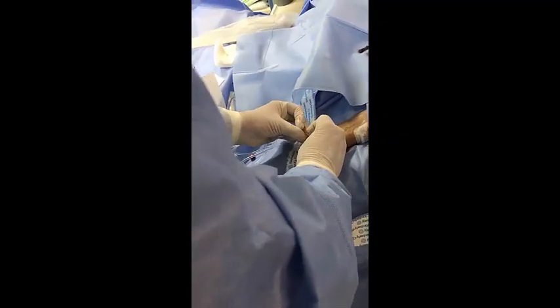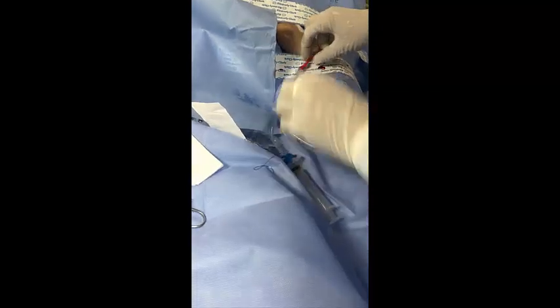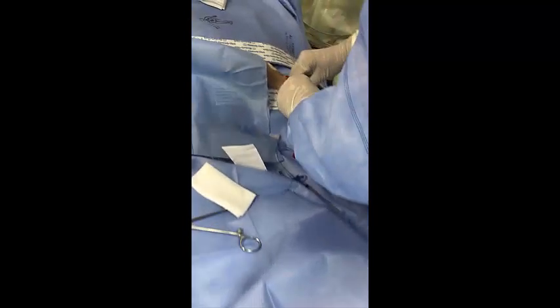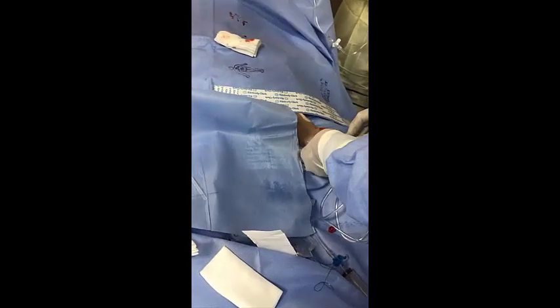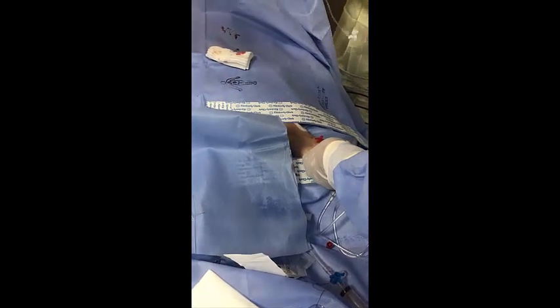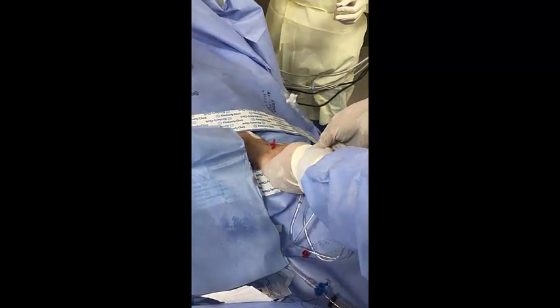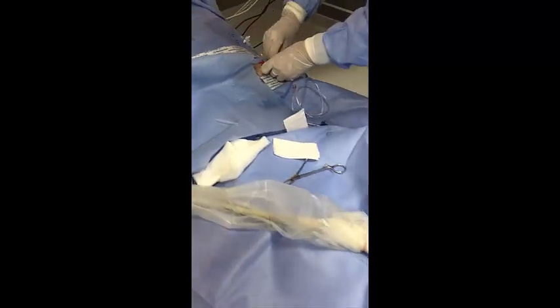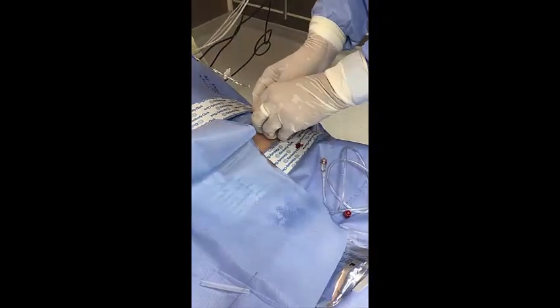I will start to flush — okay, I will close it from here. You can confirm it is okay. I can now stitch to secure the line, because it is in place.